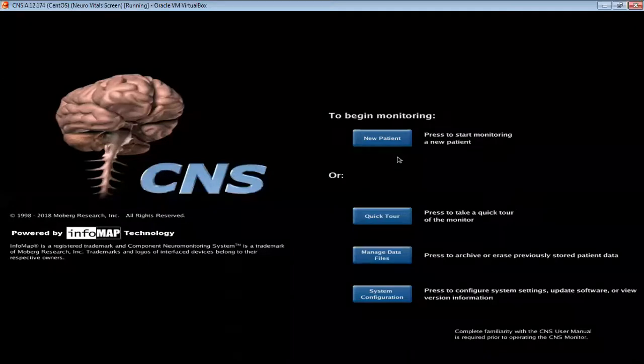It looks like there's another question, so I'll go ahead and read that because I think it really fits in nicely. So is it possible to reset to factory default protocols, or to a hospital-specific default protocol as a base to build on for known monitoring scenarios? So I think that's probably what we're going to do as a whole webinar, is how to build your hospital or patient-specific protocol.